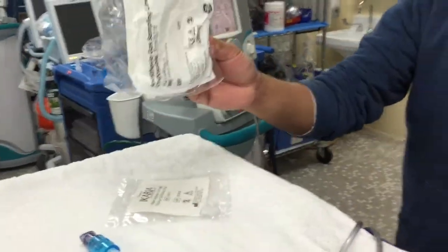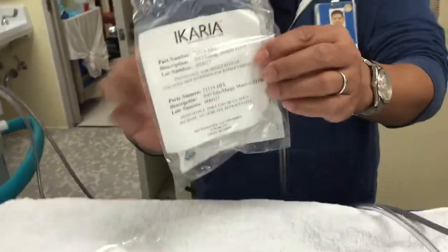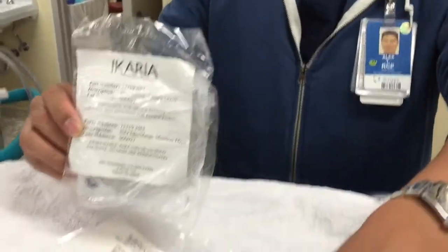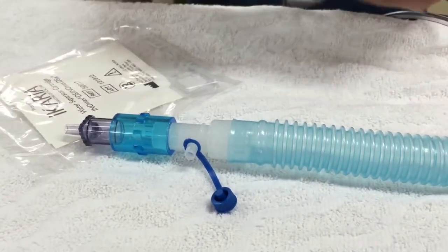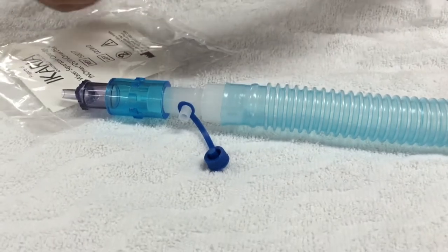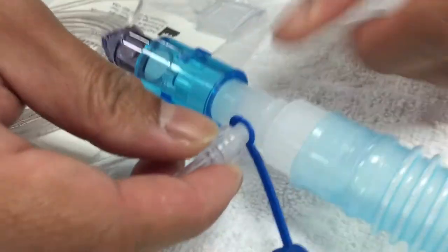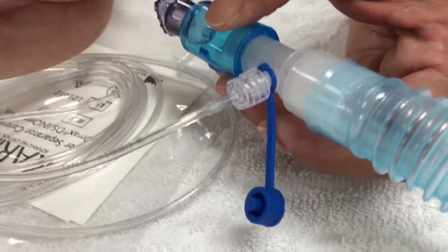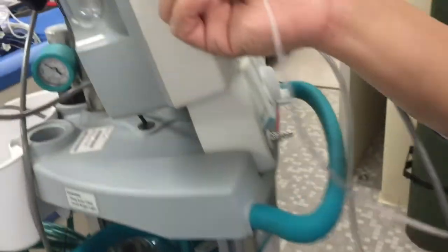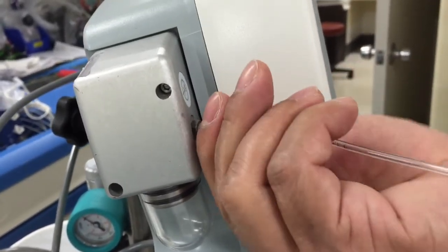A couple more connectors that we need to connect. There's this tubing — this is the sample tubing. The sample tubing goes here. Just twist that there. And then the other end of the sample tubing goes to the water trap. This is the sample port.